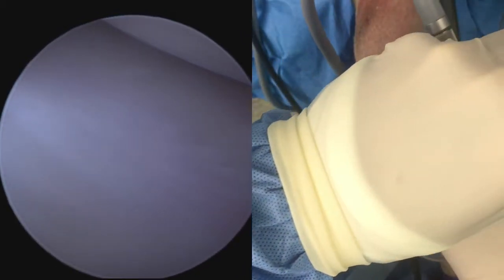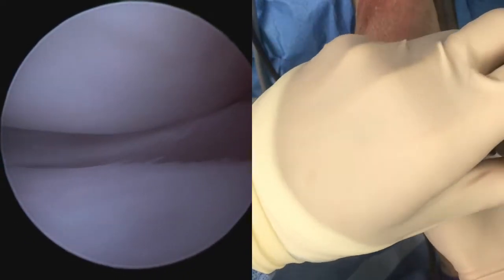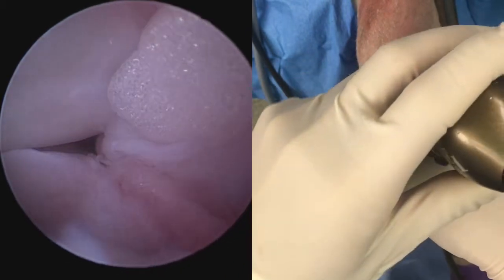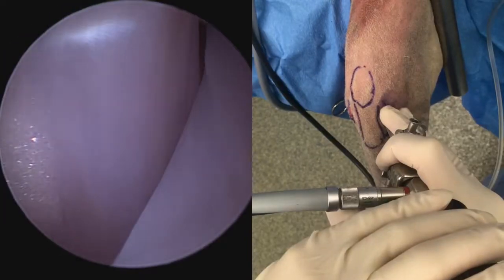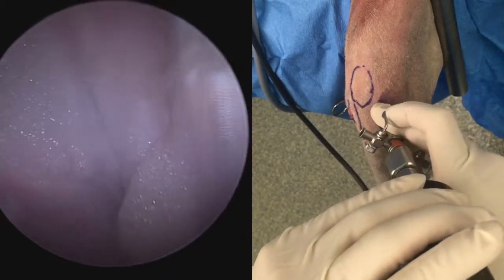At the top of the screen we have the femoral condyle. This is the mid-body caudal horn of the meniscus, and at the bottom of the screen we see the tibial condyle. Moving axially, we get a glimpse of the caudal meniscotibial ligament until we drop into the intercondylar notch, where the cranial and the caudal cruciate ligaments can be seen.